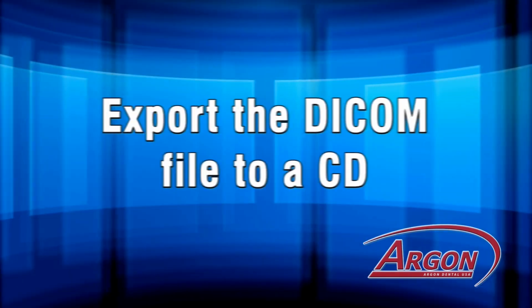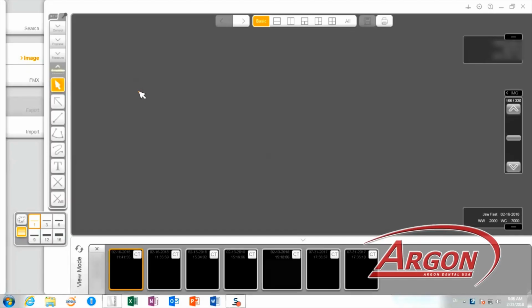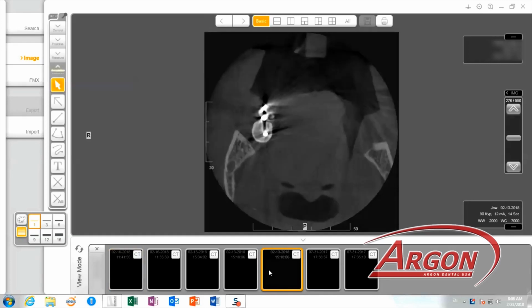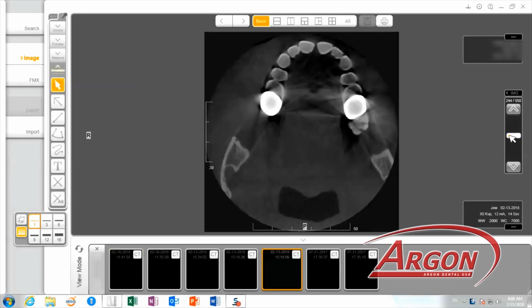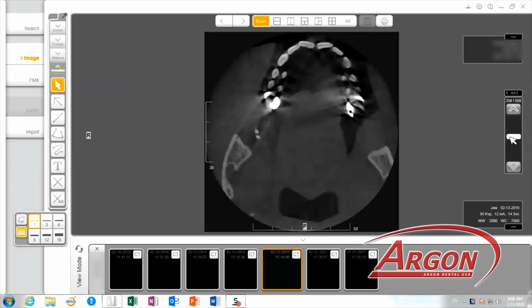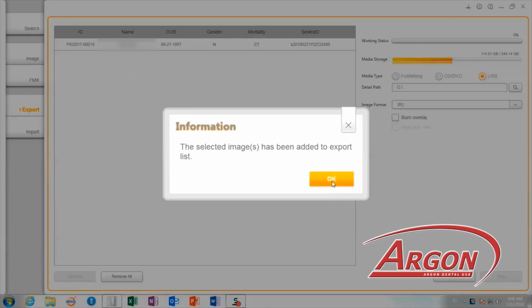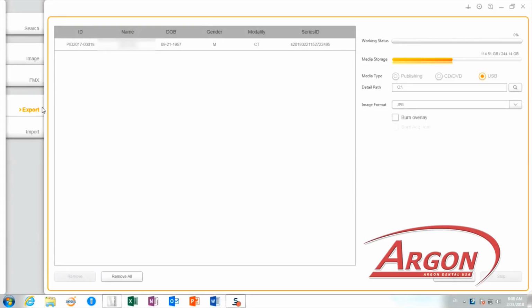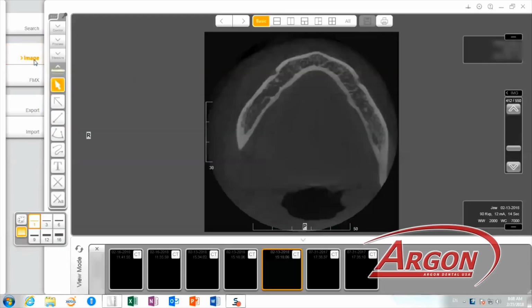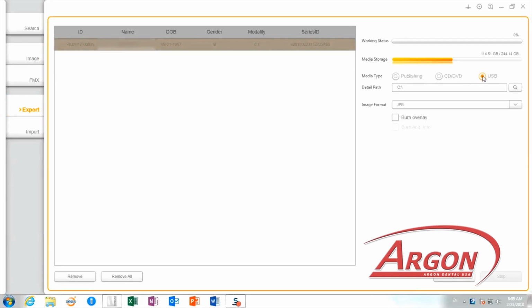Once your file is imported, you can either work on your treatment plan or send it to Implant Solutions via Case Exchange. Another way of exporting your file is to actually export the DICOM file into a CD or USB flash drive. Your CT scanner software should give you the option of exporting it in different formats. If you're exporting it to Implant Solutions, the format needed is the DICOM format. You select where you want that file to go.